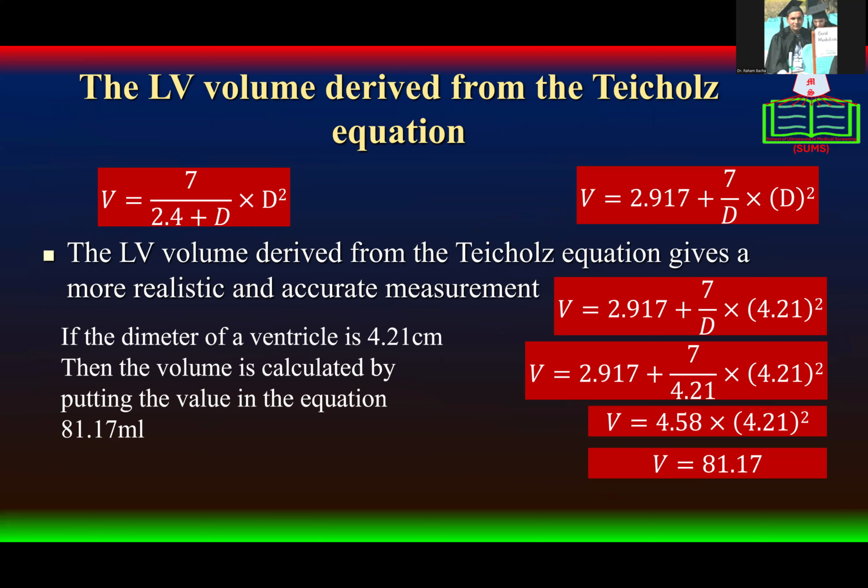Left ventricular volume derived from Teichholz's equation gives a more realistic and accurate measurement as compared to the previous cubed equation.